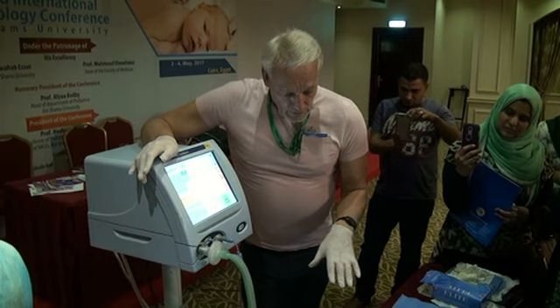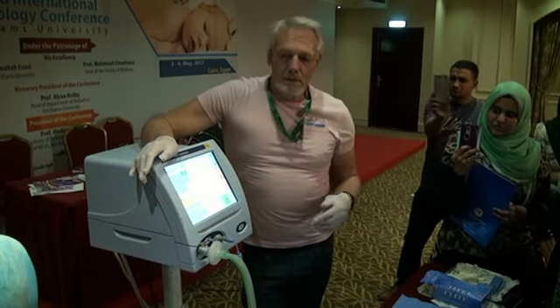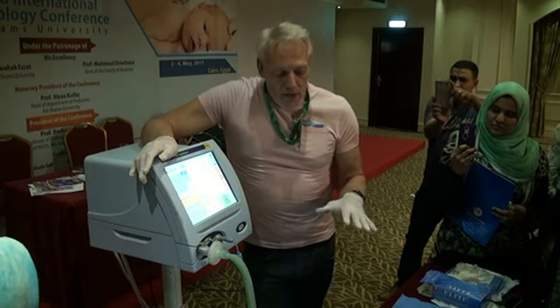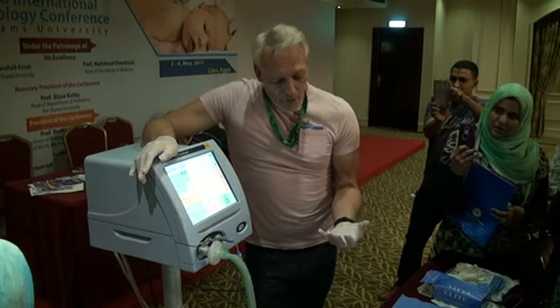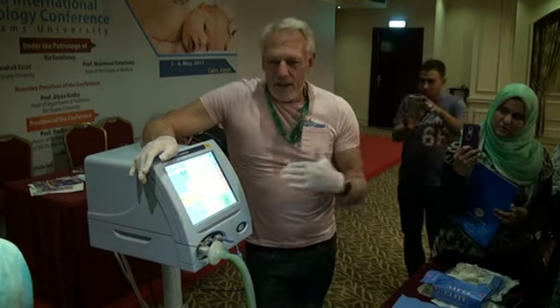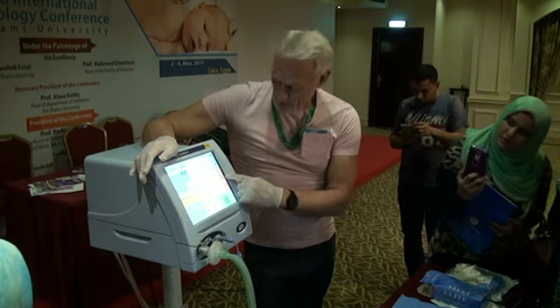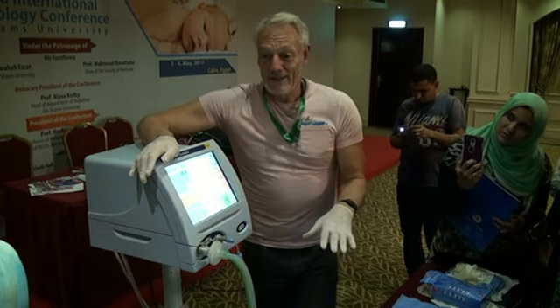Now, are those lungs well inflated? Can we tell? The only way we can tell when we're looking at the baby is if we know the baby's weight and we can guess a tidal volume. I've got a tidal volume here of 183 mils, but I don't know the size of the piglet, so I can't tell you whether it's accurate.